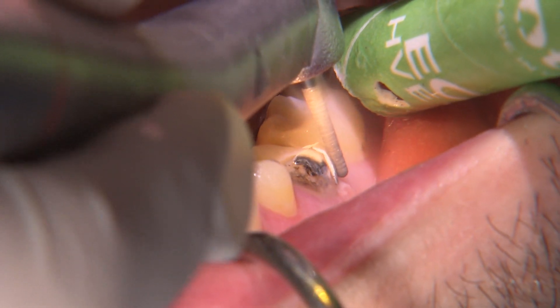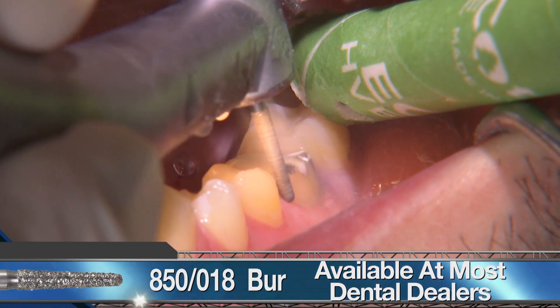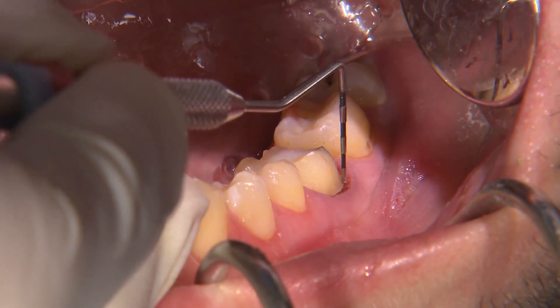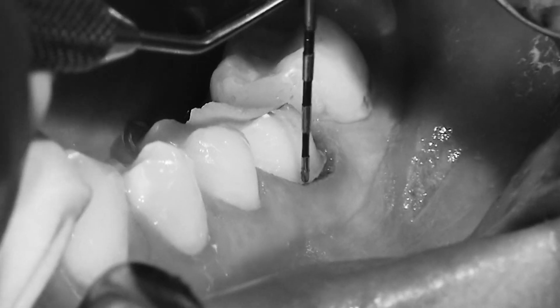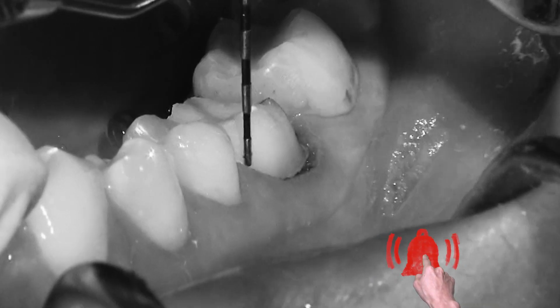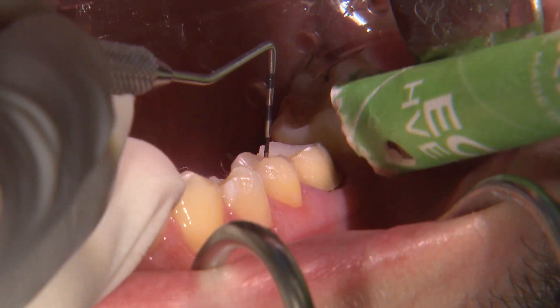On the axial surfaces, I use a coarse grit 850 018 bur to establish a 1-millimeter chamfer margin. With a periodontal probe angled toward the tooth with light apical pressure, I trace along the margins circumferentially around the tooth to verify that there's adequate reduction and it's smooth and continuous.